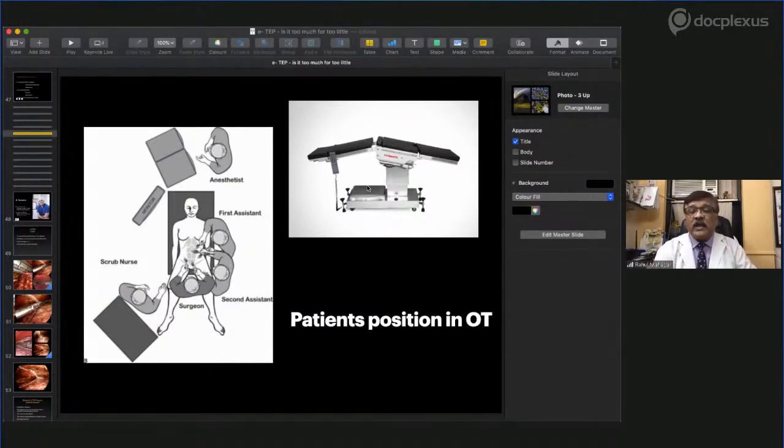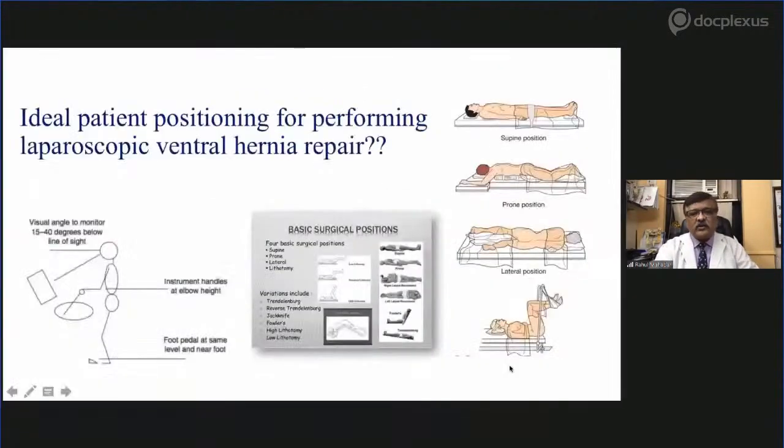That is not recommended, because I asked the operating spine surgeon at that time whether I can go ahead with this particular position. He said it is not possible. If you do this, then the implant which they have put inside will break completely. So it is not recommended, and we have done that procedure in the supine position. It becomes a little difficult for us, but yes, you can do that.